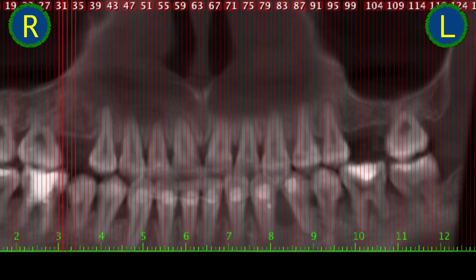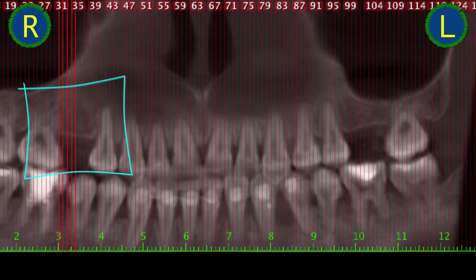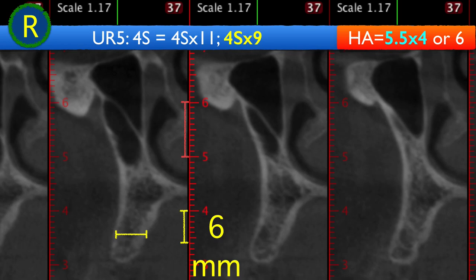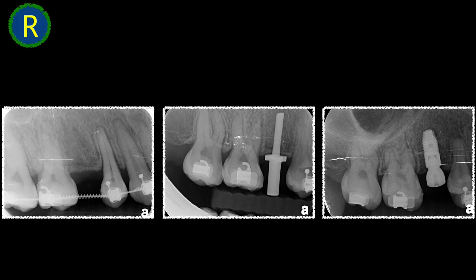We take a cone beam CT, and probably the most important part is to take the sagittal slice view. From the slice view, we're able to see the depth of the implant site. Starting with the right-hand side, which is quite easy — the thickness of the ridge bone is about 6 mm. For 6 mm, we're going to place a 4 mm diameter by 9 mm depth implant. The healing abutment will be 5.5 by 4. We drill the hole, use an indicator, and take an X-ray to check the parallelism and depth of the preparation.